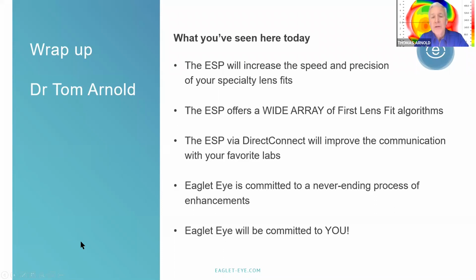And the last bullet, Eaglet is committed to enhancements, and that's certainly true. As I said, I've worked with Eaglet for now over 3 years, and Reinier and Arnie and the team. And they're very, very doctor oriented. They listen to us. They take our suggestions seriously. And if they're appropriate, they're implemented quickly.